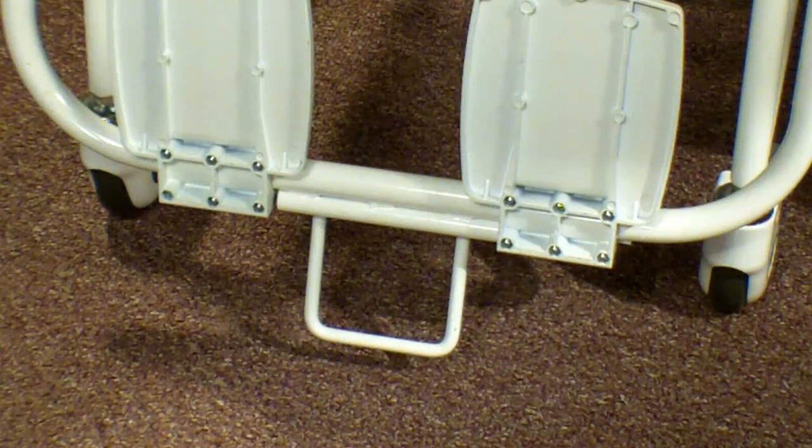The anti-tip bar on the bottom of the foot rest prevents the patient from accidentally tipping the chair scale forward when they get on or off the scale.